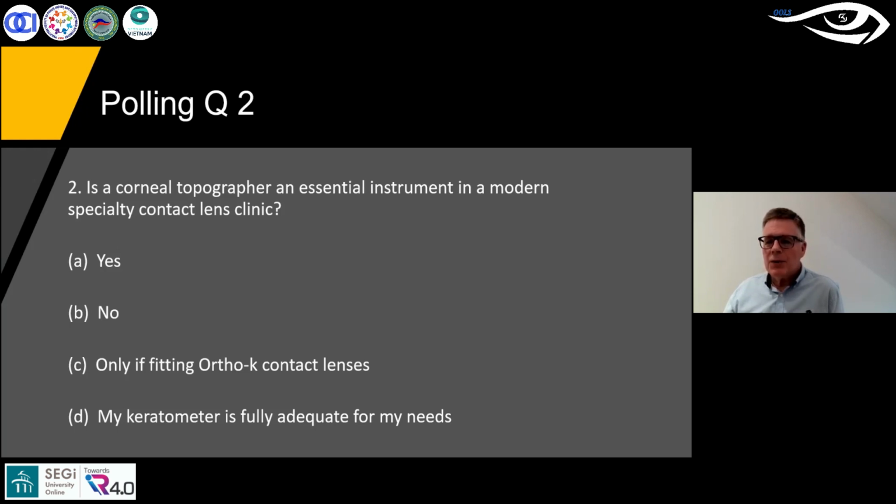I've discussed this with some of my colleagues in the hospitals in central London, where they see some very complex conditions, and they are experienced enough to put a lens on the eye and get a fabulous image of what's going on just from fluorescein patterns and assessments.